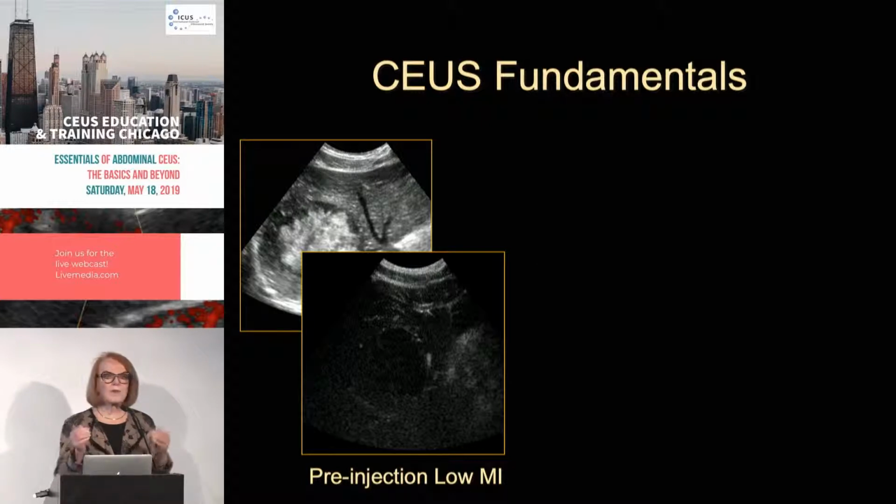The observations that you make right at this point are really critical, because the ability of the machine to suppress the soft tissue is related to the nature of the makeup of the mass. So what do I know by looking at that mass on ultrasound, not using CT or MR sophisticated techniques, but the only echogenic tissue which we can't suppress, what is that going to be?